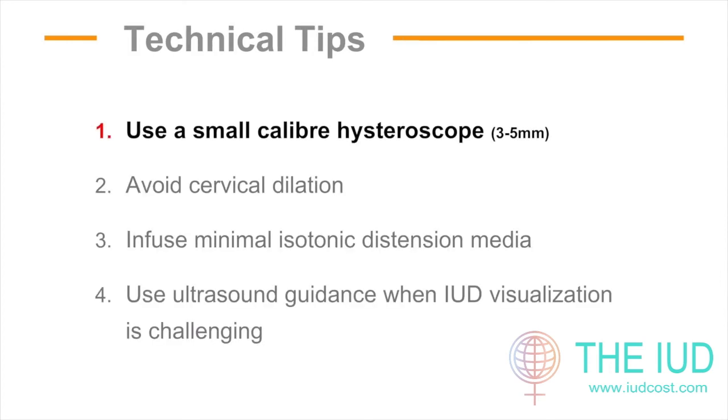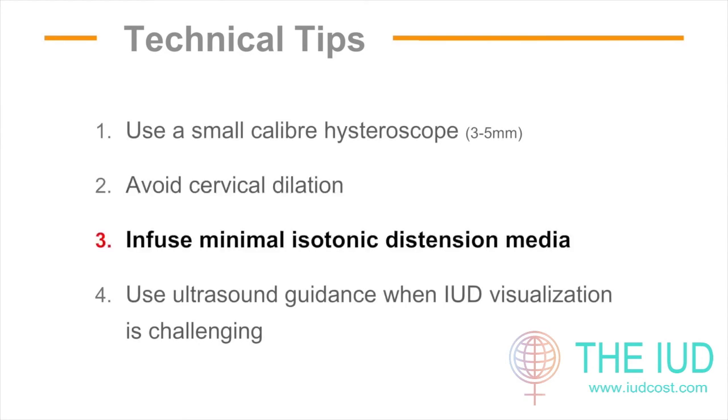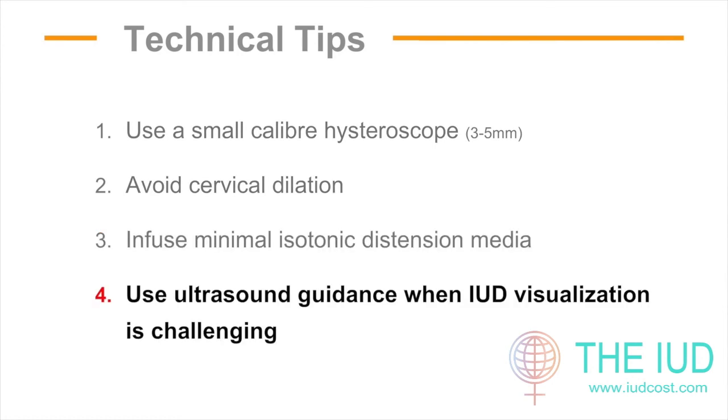Technical tips to help facilitate this procedure include using a small caliber hysteroscope, avoiding cervical dilation, infusing minimal volumes of isotonic distension media, and using ultrasound guidance when IUD visualization is challenging.